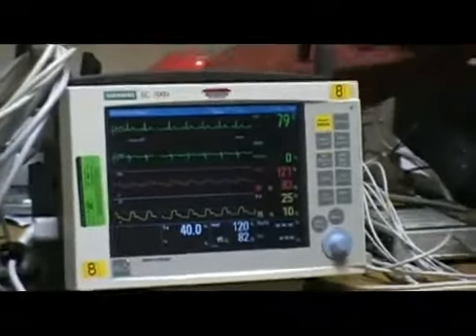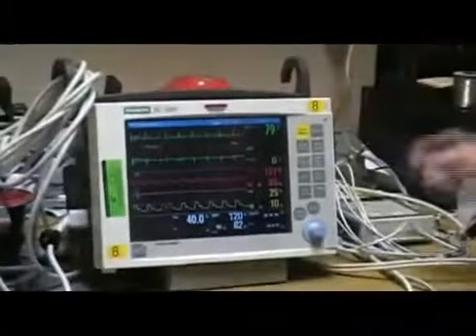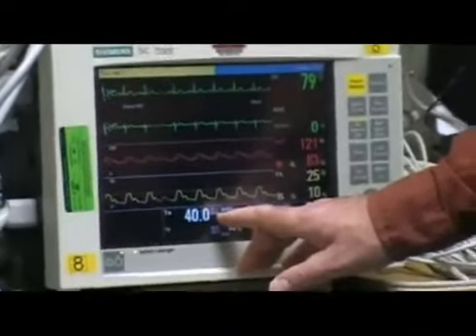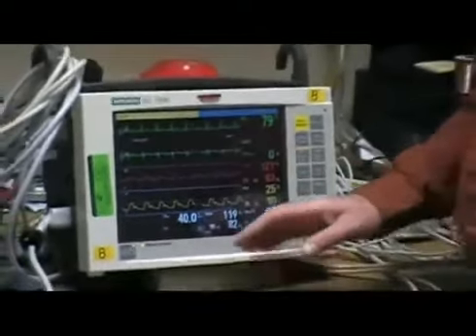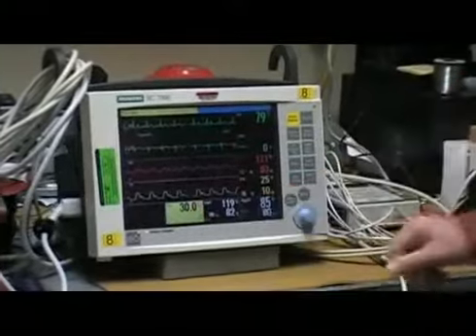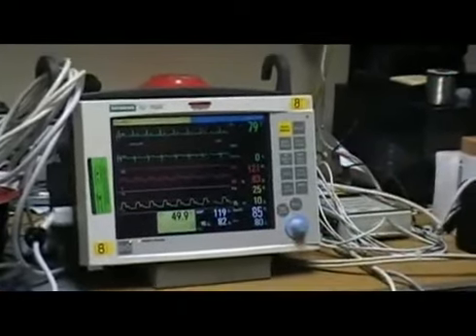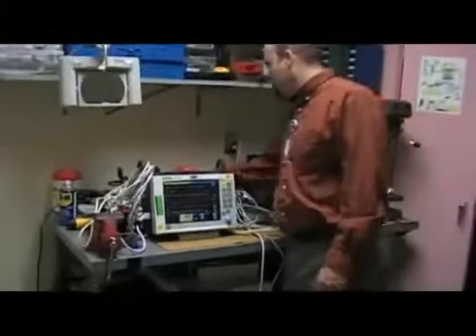And then we want to test for temperature. Got a simulator back here for that, and right now it's set at 40, which is right on the money, and we want to check for alarms, so we go down to 30. Now we're back because the alarms weren't set right. We had to change the upper and lower limits for the temp alarm to go off, because they can be changed with whatever the nurses or doctors want it set for. So we have it set now so that at 40, the alarm is off, and go to 30 degrees Celsius, and you get your alarm because it'll come on at 34. Then go up to 50 for our high limit, which at 46.2 it'll come on, and at 49.9 it's on. Also our limit for the temperature is plus or minus 1 degree Celsius, so we're within limits on that also for the upper and lower.